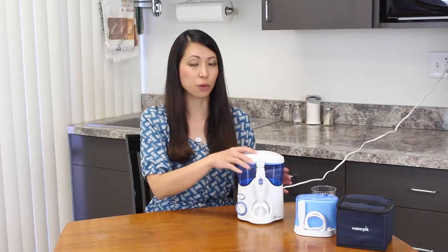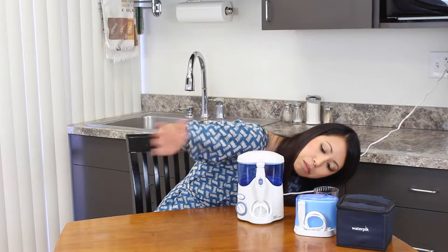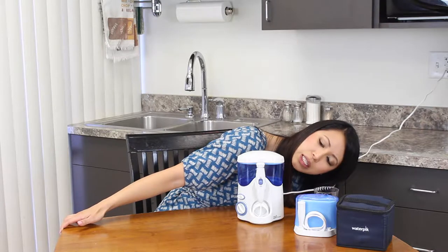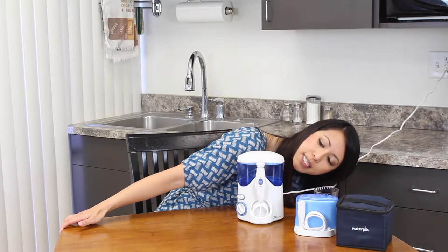So the first thing you would do is fill the reservoir tank with water. The tank can accommodate up to 19 ounces or 600 milliliters of water.